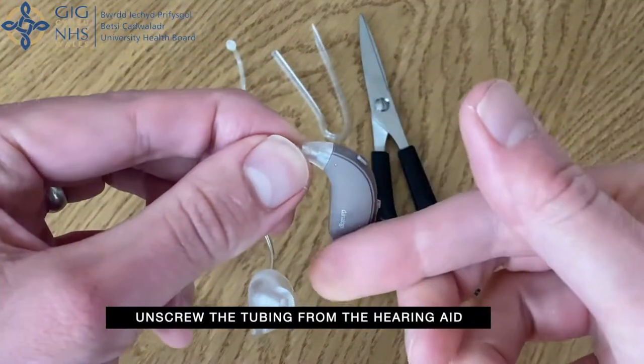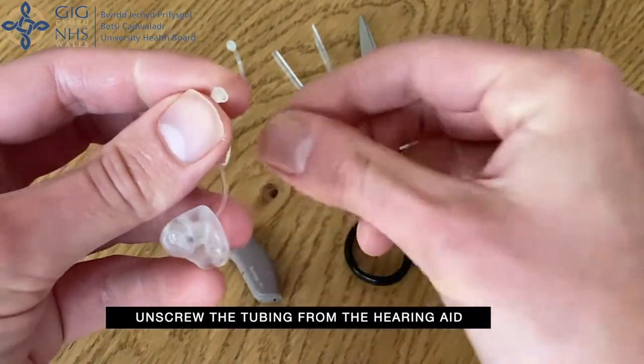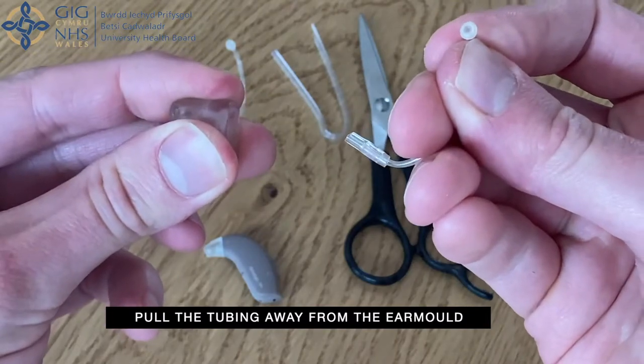Unscrew the tubing from the hearing aid. Pull the tubing away from the ear mould.